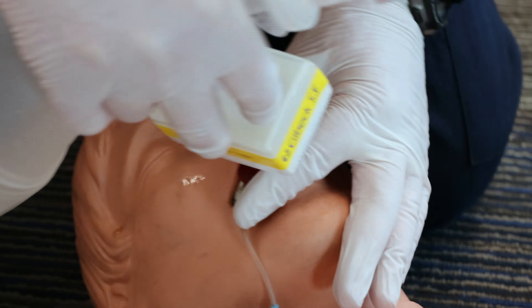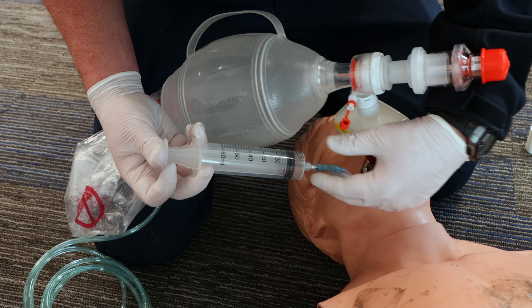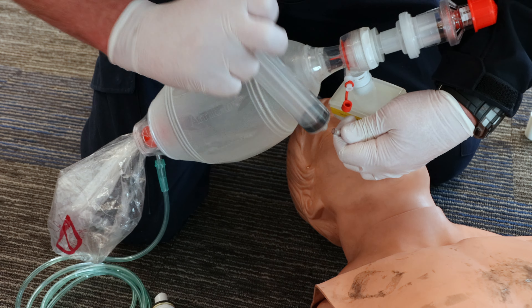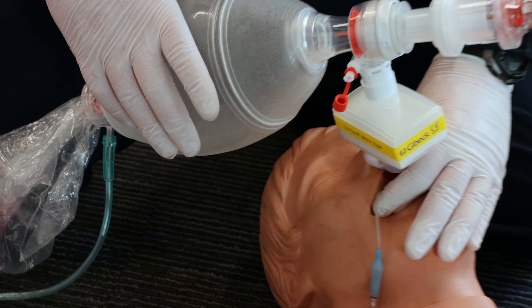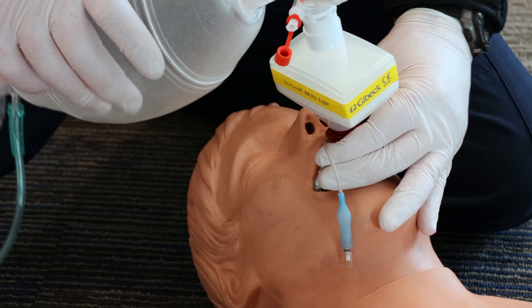It calls for 60 to 80 cc's of air, so there's 60 — and there's 80. Then you check for how your compliance is, and if it's poor, you start to back out your tube just a little bit until it improves.